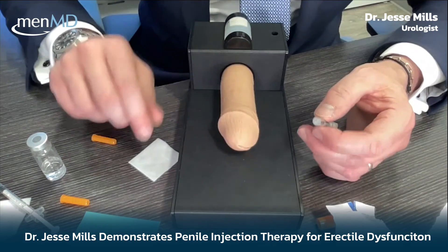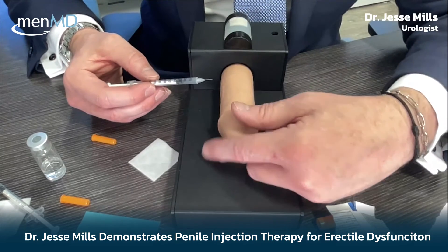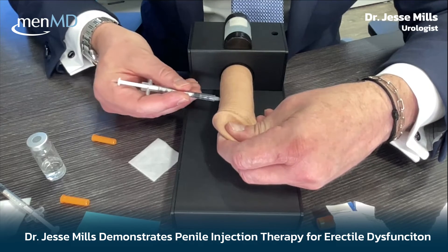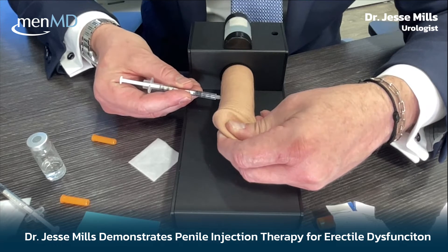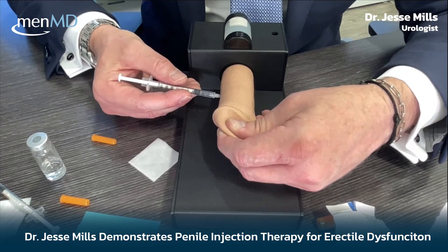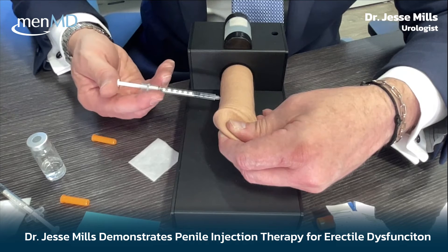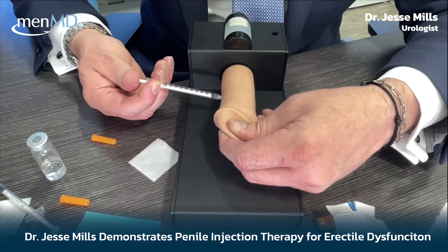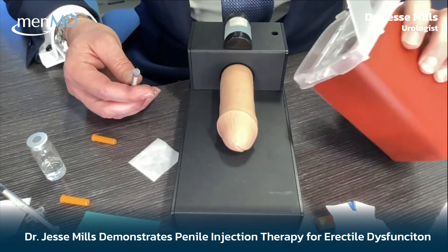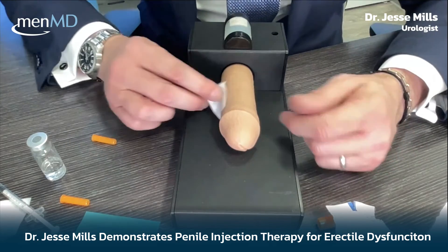Once you've selected your site, hold yourself on stretch and grip the needle firmly. Plunge it in until you see it fully hubbed, making sure you're in the meat of the shaft. Just do it — if you're too superficial, the medication won't reach the right spot. Once it's in, get into position to inject, pop it in and out, then immediately place the used needle in a sharps container by your bedside.